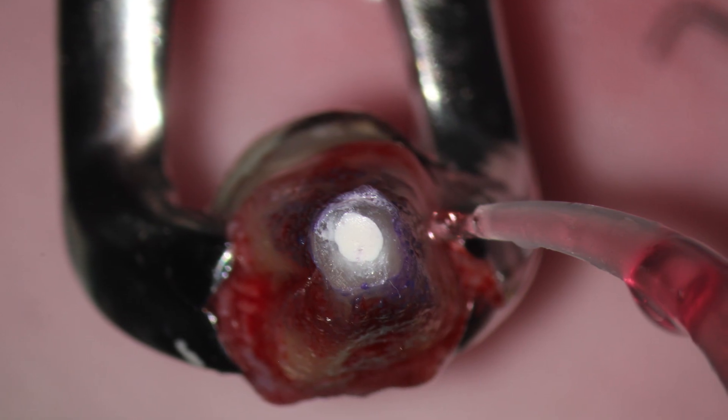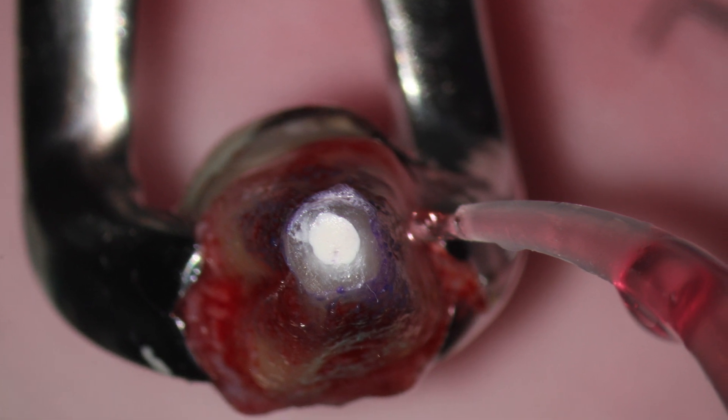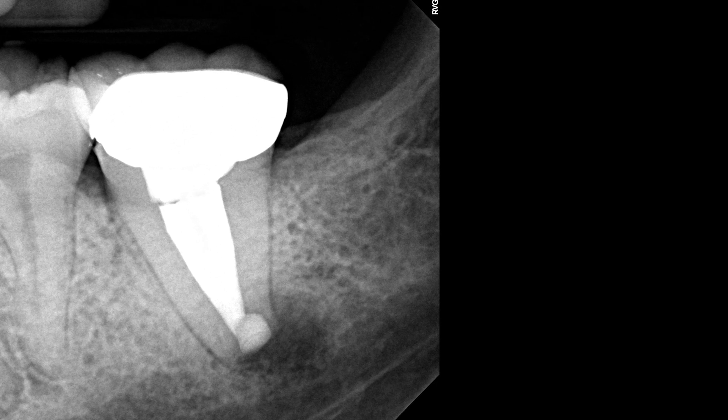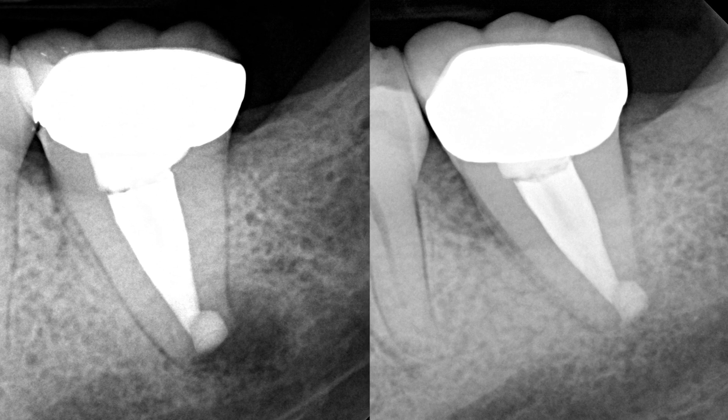As you can see, the tooth is kept wet at all times with Hanks Balanced solution. This is a post-op radiograph right after the re-implantation, and this is a follow-up after two years showing complete healing.